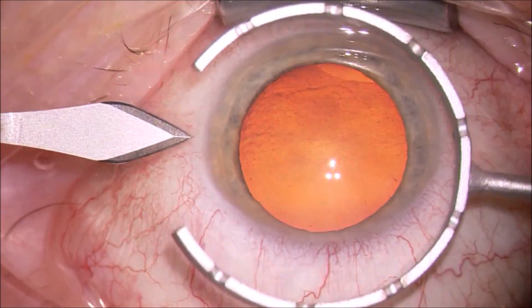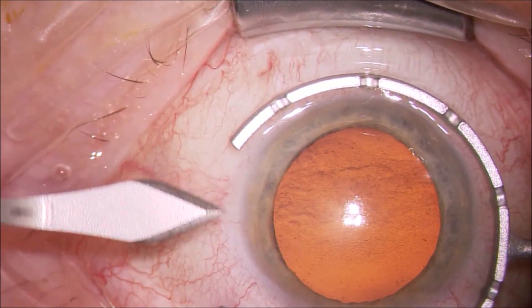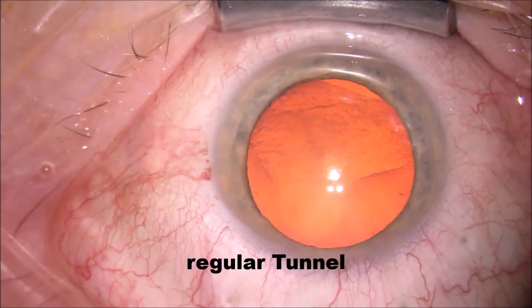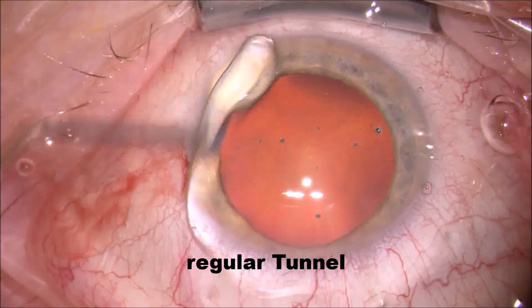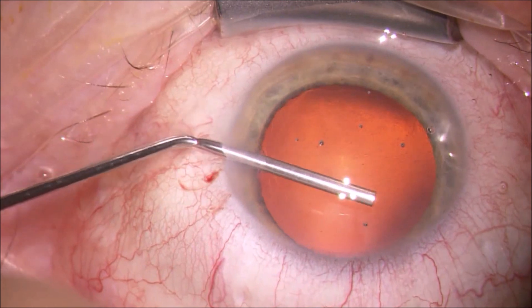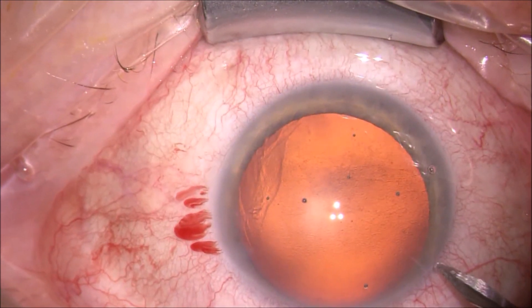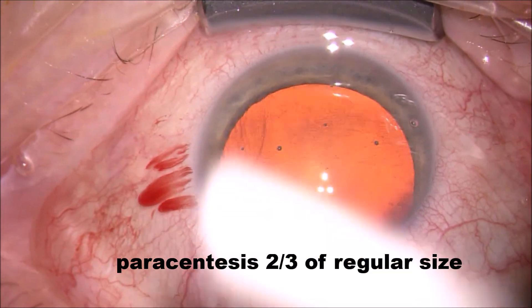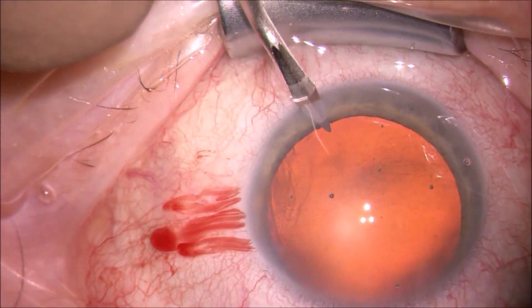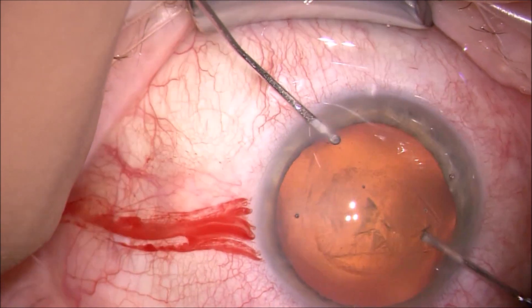Just a couple of thoughts while we watch me doing the regular FACO. The design of the tunnel is pretty much the same that I use for a FACO approach. I don't want to be too long in order not to mess with my inner diameter of the endothelial rexis. I use a cohesive and dispersive viscoelastic. I'm now designing the paracentesis at two-thirds of a 23 gauge.